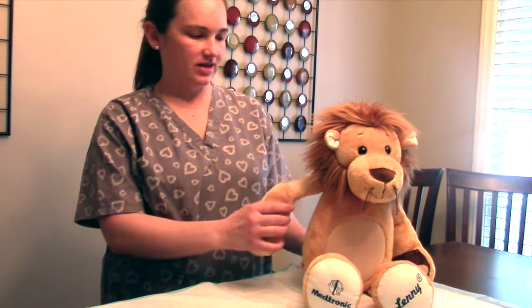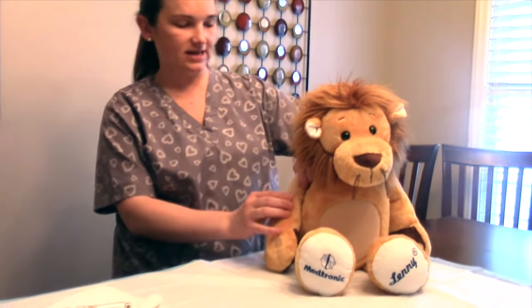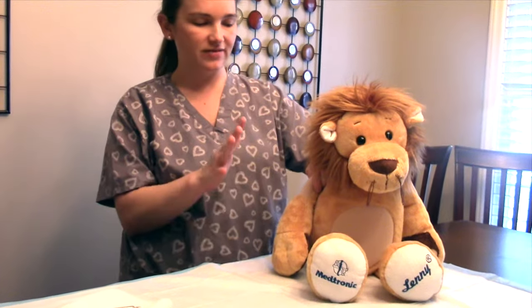Now that the needle is primed and ready to go, we're going to go ahead and administer the insulin. Lenny is going to help me. We will give it in his arm. What you're going to want to do is pinch up the skin and either give it at a 45 or 90 degree angle depending on the size of the child.